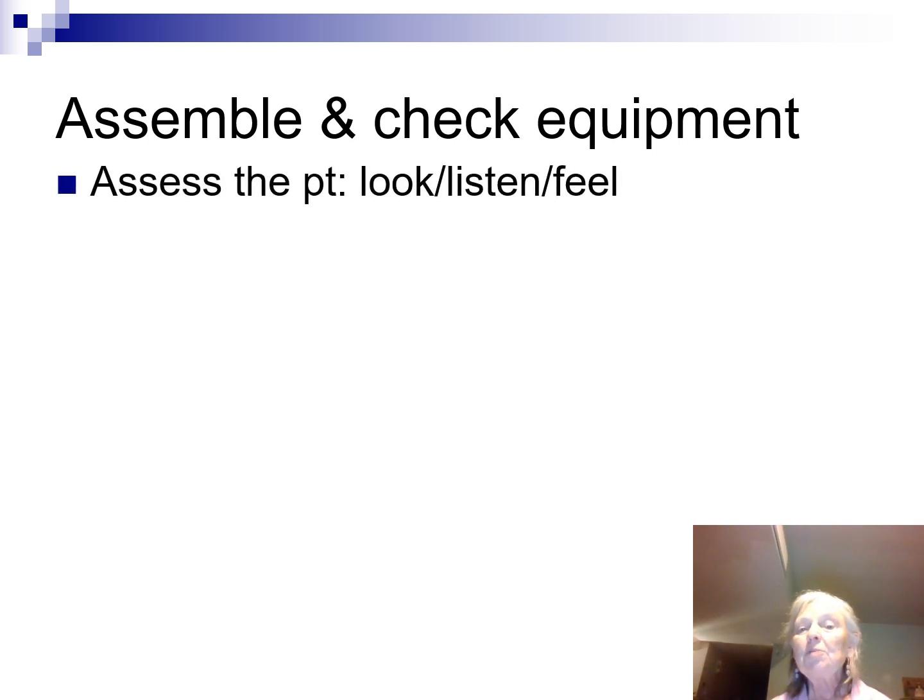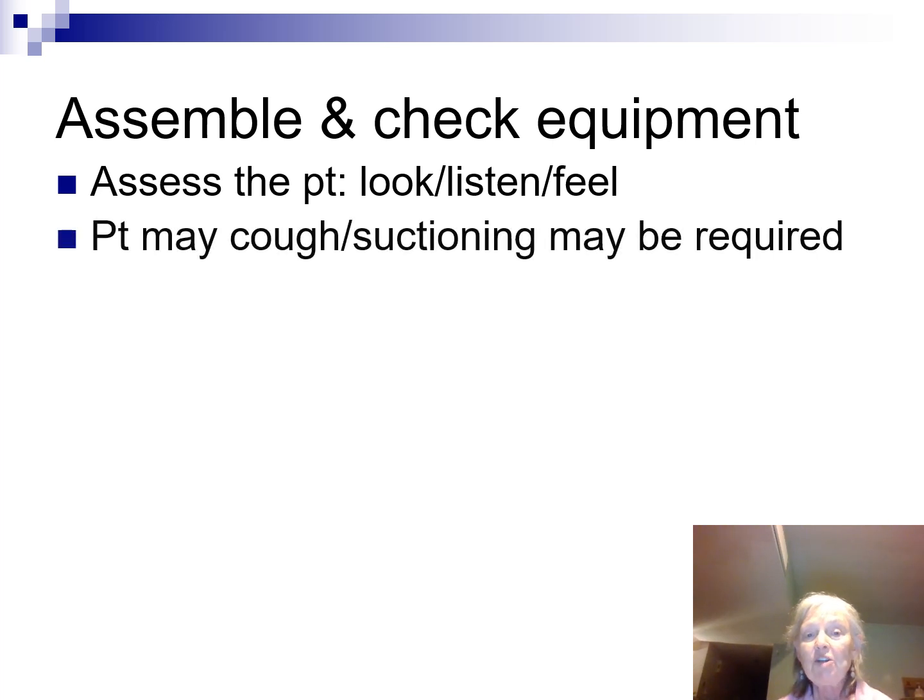So we want to look at these patients, and we want to see, do they need to be suctioned prior to the start of doing our trach care? Your patient may cough, and suction may be required. Sometimes we've gone in there, assessed the patient. We knew they had some secretions, but the secretions weren't to the point where they needed to be suctioned at that particular point. Throughout the procedure, they were starting to build up more secretions, and they finally coughed and the secretions started coming out. And then we needed to go back in and remove those secretions.